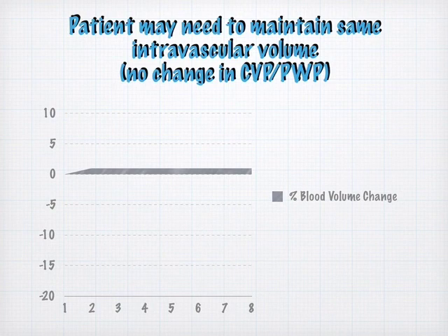So that ended up kind of being where the graph that I tried to achieve was something sort of similar to this, but perhaps between 0 and -5% is kind of where I stayed, because that was a pretty safe zone where I knew that I wasn't going to dehydrate the person to the point where they were being symptomatic, but I was taking off some fluid. And it seemed from my experience actually that I had to start removing some fluid in order to get them to start mobilizing fluid. And so this is the graph that I shot for most of the time.